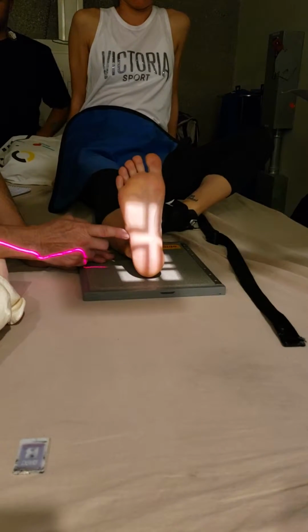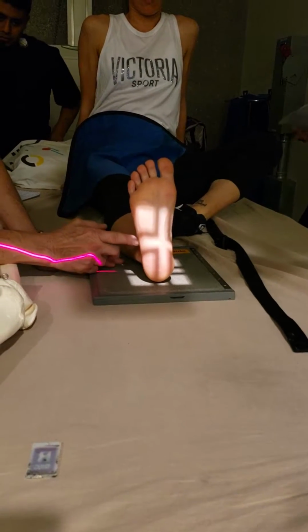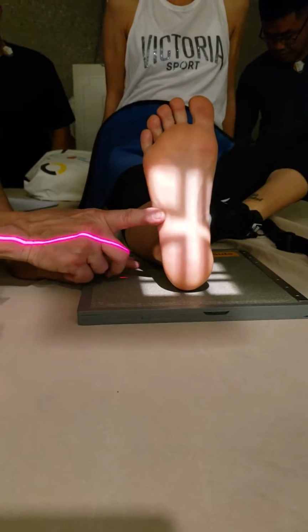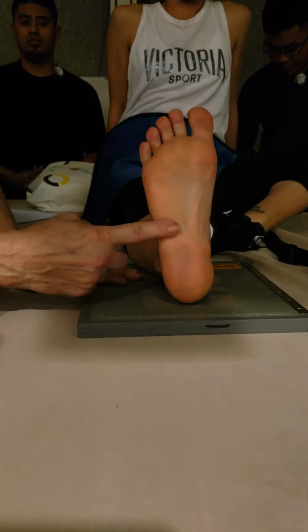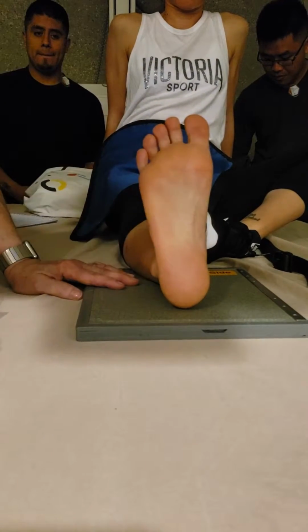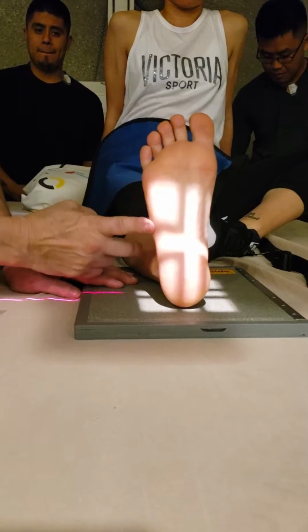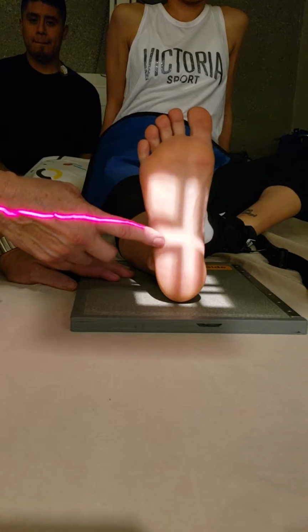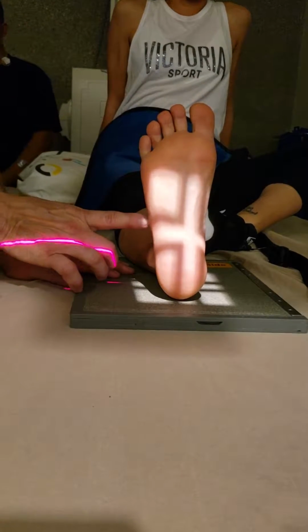And how can I tell where the third metatarsal is? Because the bump is the fifth. So if I put my finger at the fifth, you go just below that, that's going to hit right at the third. So palpate the fifth. Go just below that, like this, the top of the two lines can hit that fifth, and that'll tell you that the middle white line is right in the center.